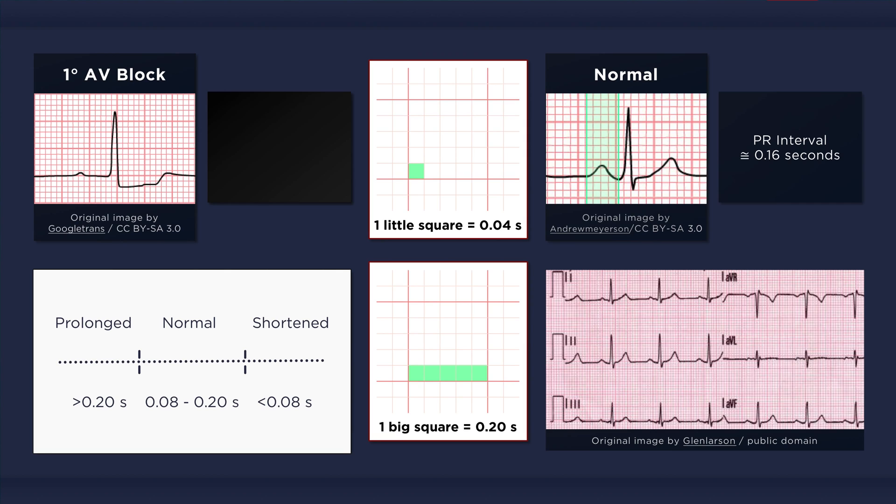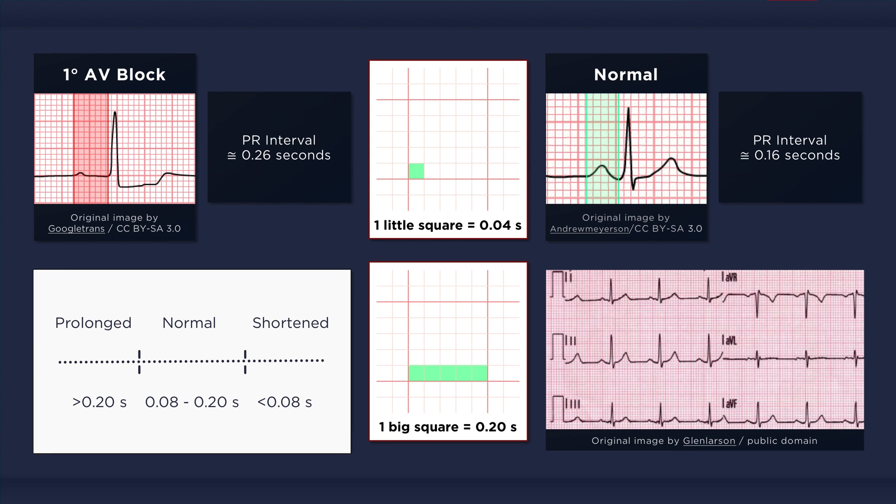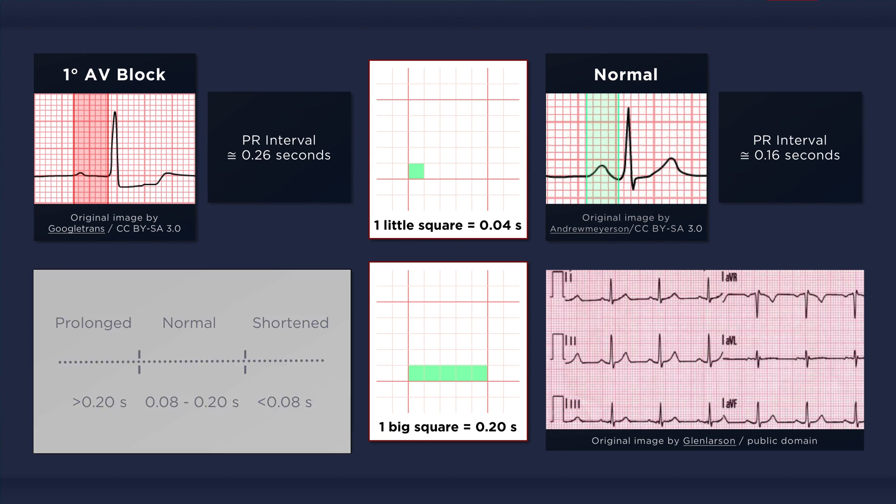Now let's go back to the ECG with first degree AV block on the top left corner of the screen. We can see that approximately 6.5 little squares fit within the PR interval. This equates to 0.26 seconds, which is prolonged. Now in the ECG on the bottom left, the prolongation is less clearly evident. But on close inspection, we can see that the PR interval is indeed longer than one large box, thus it is greater than 0.2 seconds in duration.